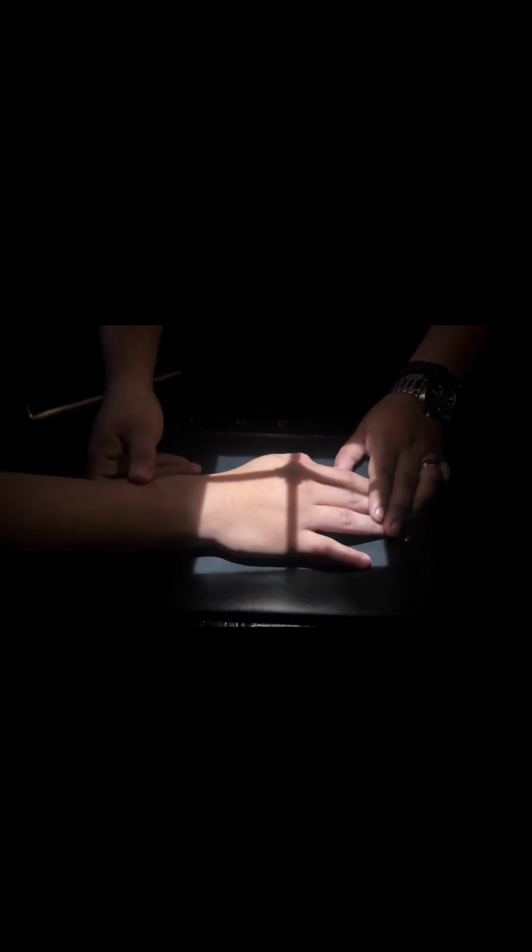So for my last projection, which is the lateral projection, the extended lateral, the patient position for this is patient seated at the end of the table with forearm resting on the tabletop. Clinical indication for this is fractures and dislocations of the hand and wrist, localization of foreign bodies, demonstration of anterior or posterior displacement of fracture.